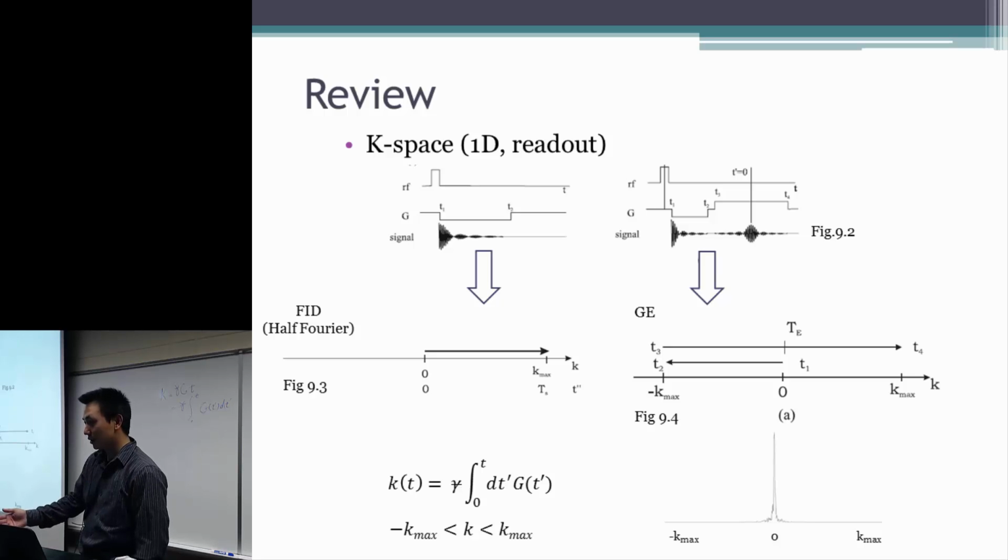As we already know, the center of the K-space contains the global signal, the signal baseline, and the low spatial frequency components, while the edge of the K-space contains the high spatial frequency components.